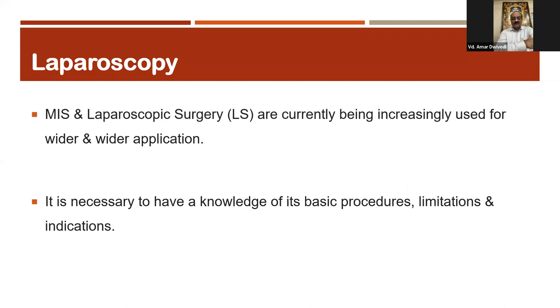Minimal invasive surgery or laparoscopic surgery is currently being used for wider and wider applications. Initially it started only for diagnostic purposes, but nowadays it is for therapeutic purposes. In the present scenario, in most surgical cases the surgeons try to operate with the help of the laparoscope. So it is necessary to have knowledge of the basic procedure, its limitations, and its indications along with contraindications.